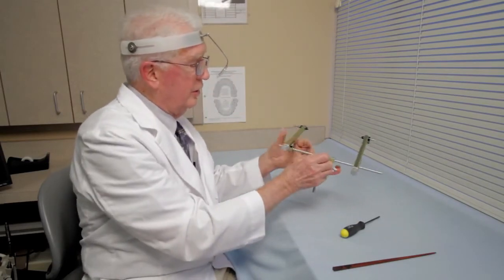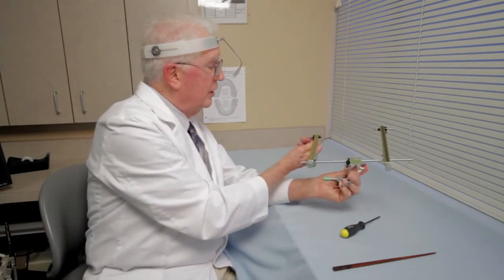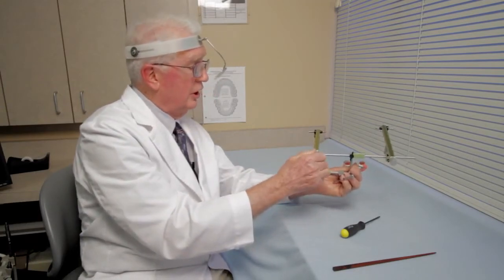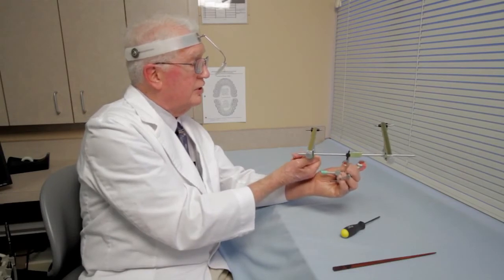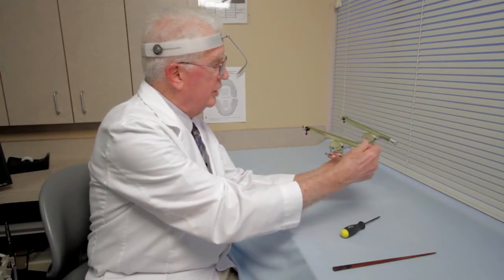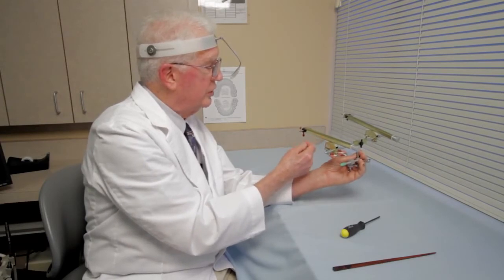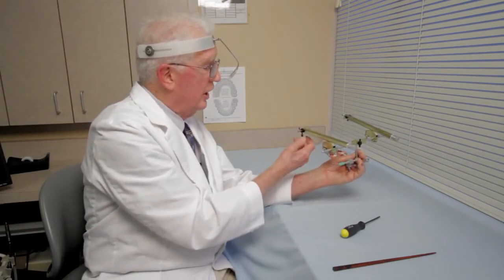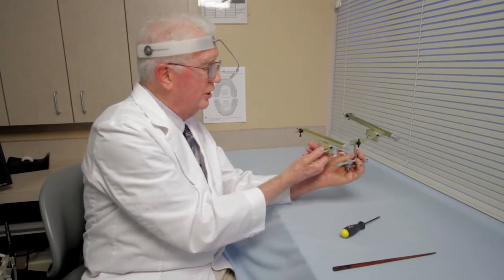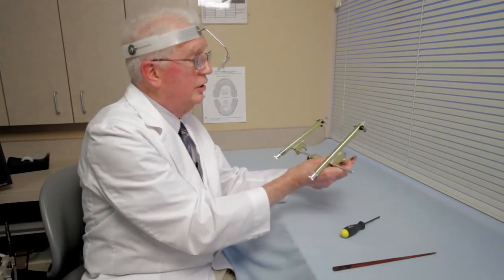And then while this is on the patient, I can then move the stylus pen now in close to the skin, and I can make my anterior, posterior, and vertical adjustments as needed to set the stylus pen exactly on the hinge axis mark. Once the stylus pen is set on the hinge axis mark, I can then lock the stylus pen in position, lock the sidearm in position. This is locking the vertical. And then I would do the same thing on the left side.